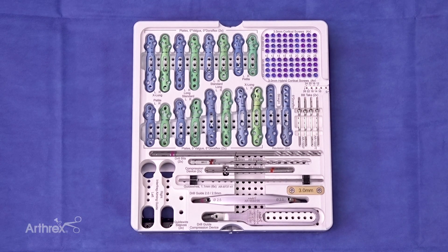I'm Brad Drescher from Colorado Springs. Today we're going to demonstrate a first MTP fusion utilizing the MaxForce first MTP fusion set.